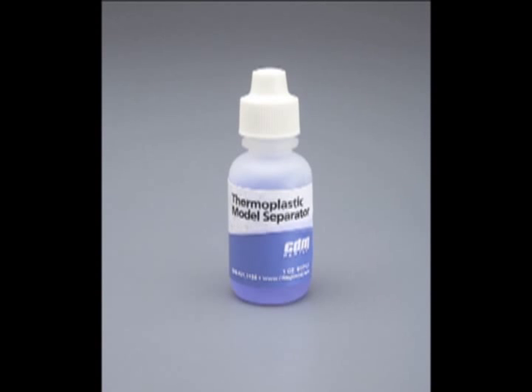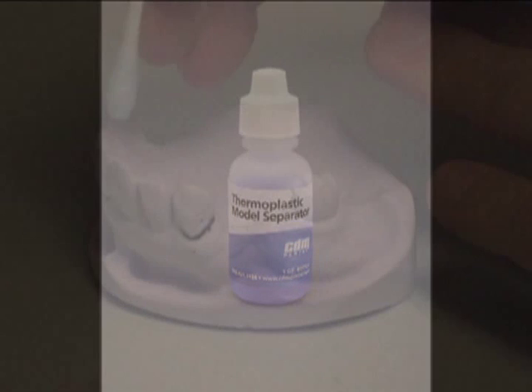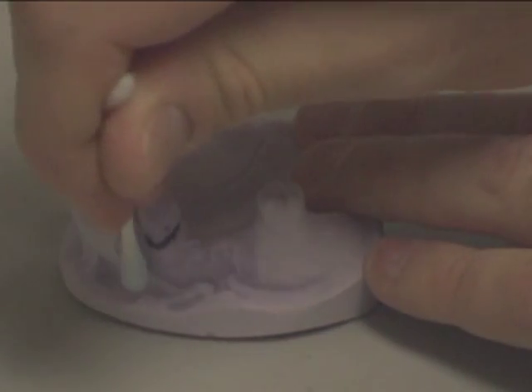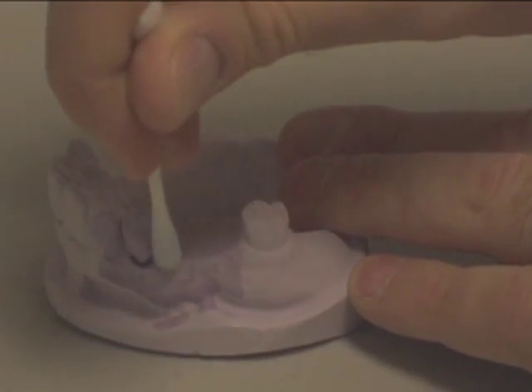Using CDM Dental's Thermoplastic Model Separator, paint the area on the model where the clasp will touch. Be sure to wear eye protection and to use proper air ventilation.